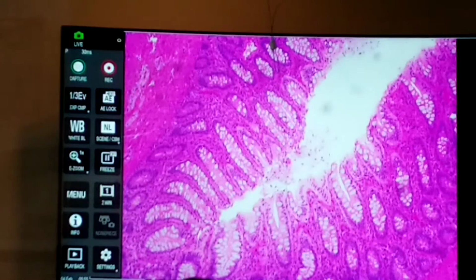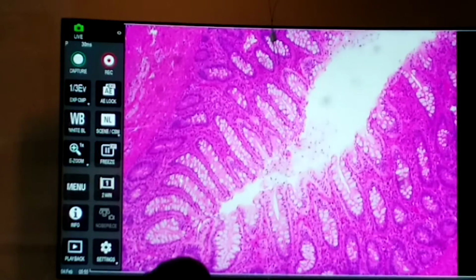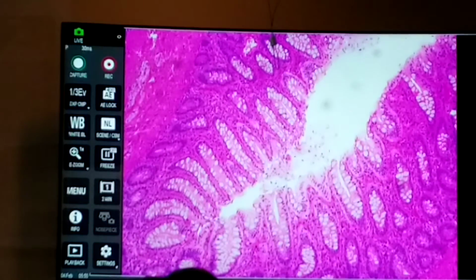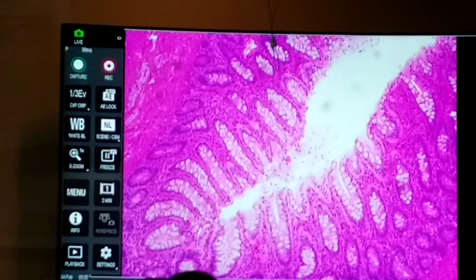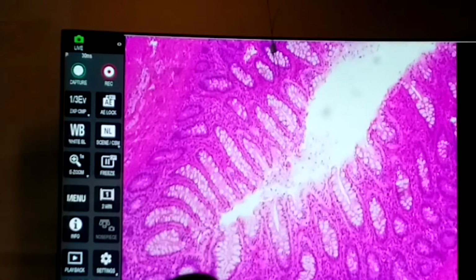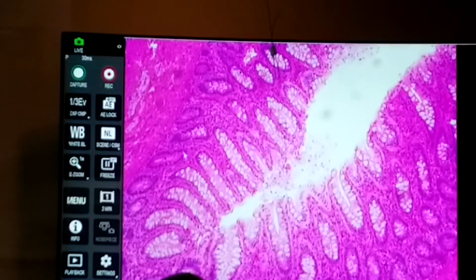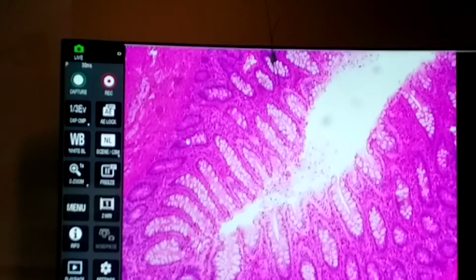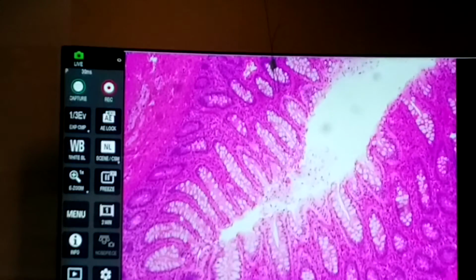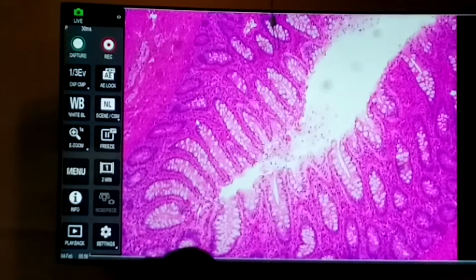Those are glands. They just extend down from the surface epithelium. They connect to the surface epithelium. And the shape of these glands, these are simple tubular glands. In other words, the duct doesn't branch. Down here, they're reaching down to these secretory units down here. You don't see the connection so much. But these are just simple, straight tubular glands that are extending down to the lamina propria.